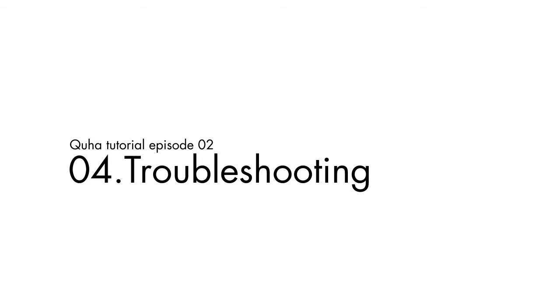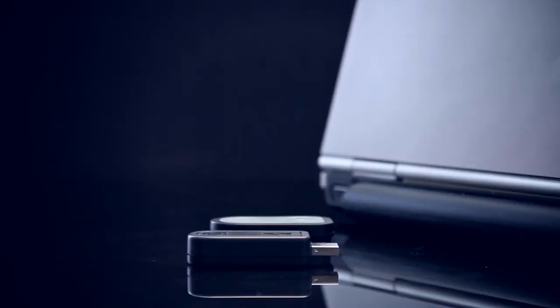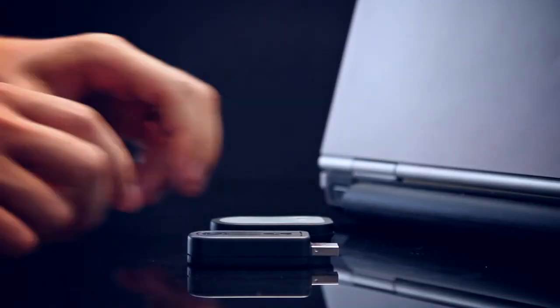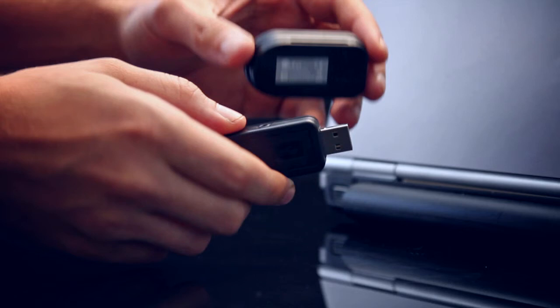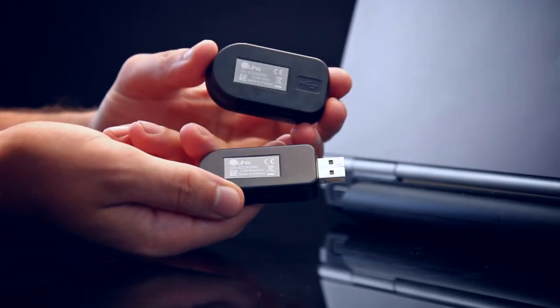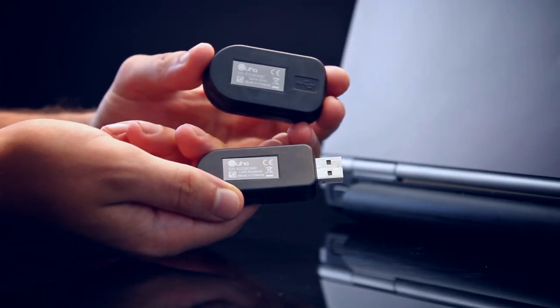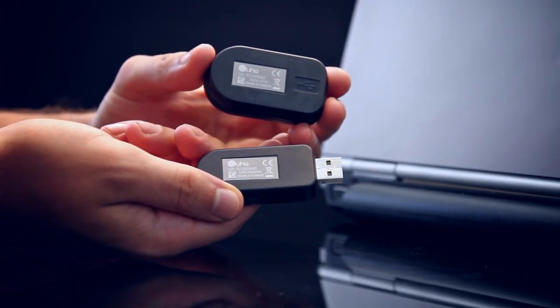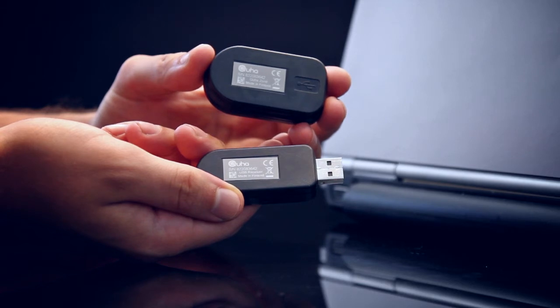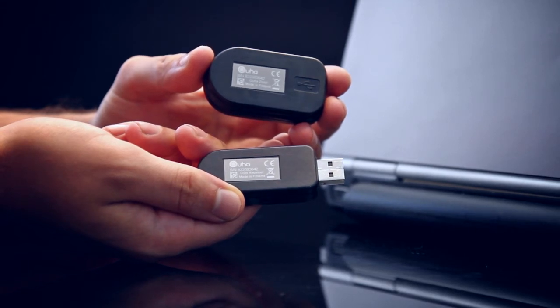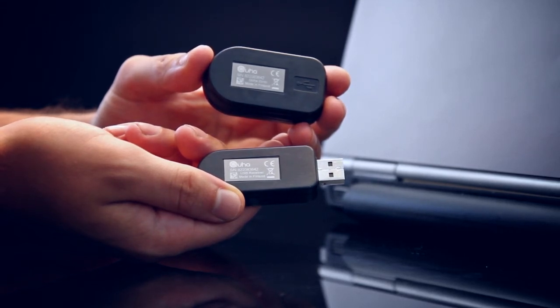If you suspect that your ZONO might not function as it should, please check these basic points. First, check that the USB receiver and ZONO have the same serial codes on them. Each USB receiver and ZONO is programmed to work with its designated counterpart.